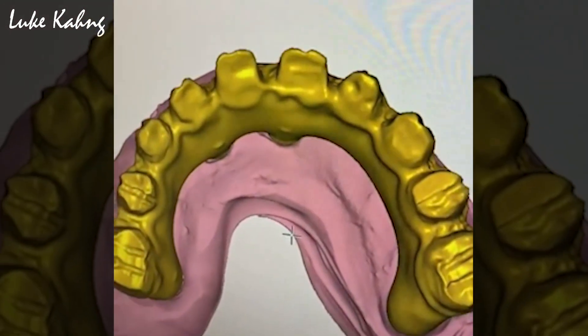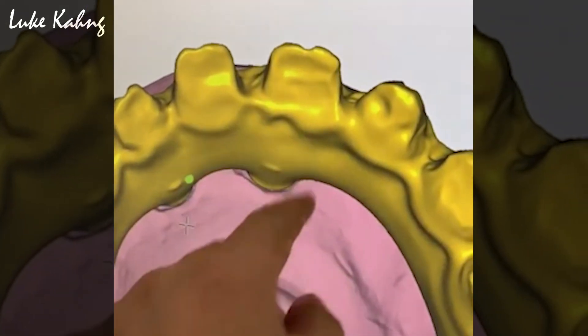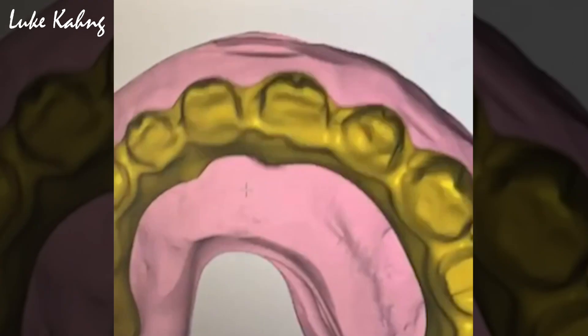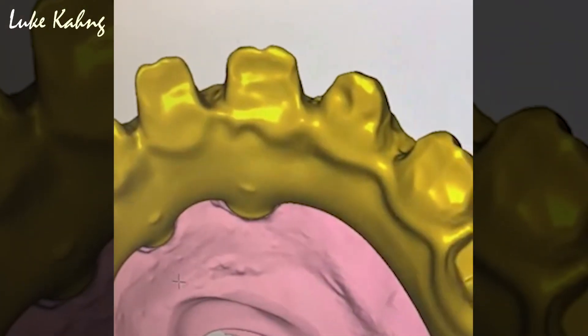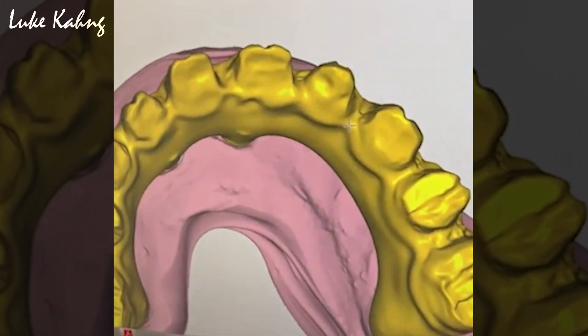Occlusion view. Make it a little more. Multi-unit. Can you make it a little longer? The access holes right there. So I brought it in. It's a little bit soft over there. Bring those in.